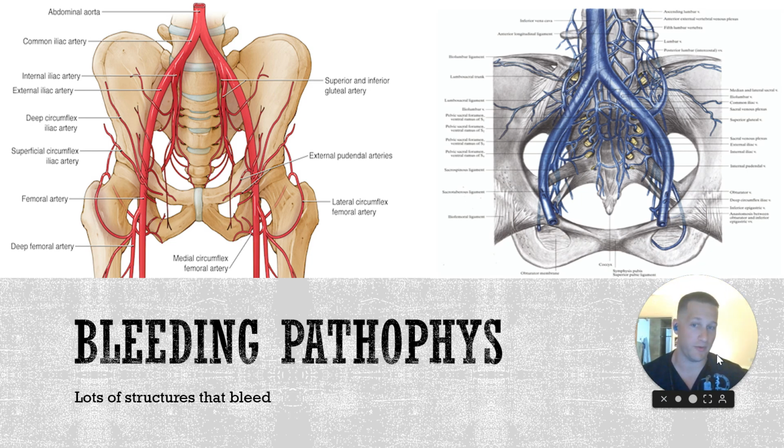And the goal of the pelvic binder is to hopefully bring your pelvic fracture fragments together to stabilize any bleeding that is there. The problem with pelvic bleeding is that, like in the TCCC tactical field care scenario, it's very difficult to control internal bleeding. You cannot apply a tourniquet to it. You cannot apply wound packing or anything to injuries deep within the pelvis, and you can bleed a ton into the pelvis.